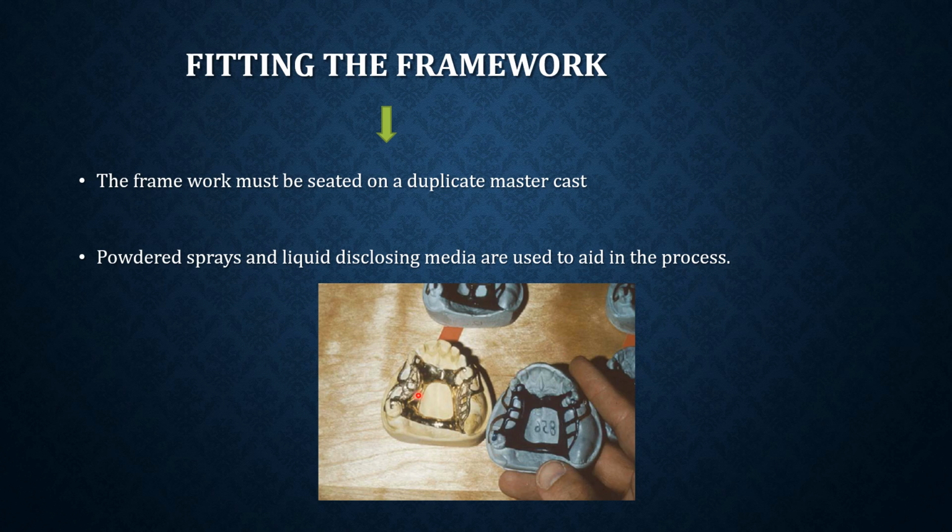When he fits it, ideally it should fit. If there's a problem, he'll adjust and send the prostheses to us in the clinic. Sometimes, yes, guys, we find that there's a problem in fitting, and we try to improve that problem and it fits. Sometimes there's looseness in the clasp, and then we need special pliers to adjust it.